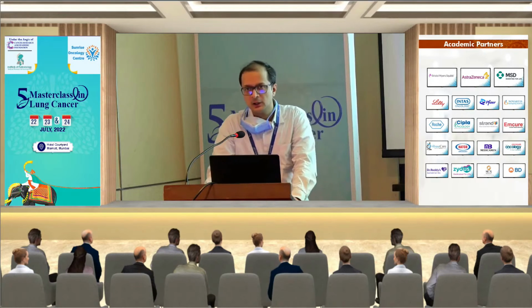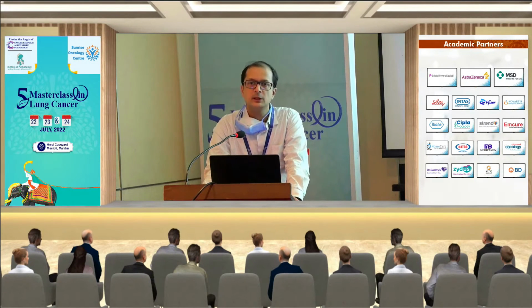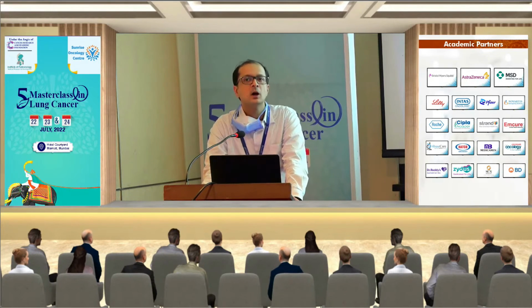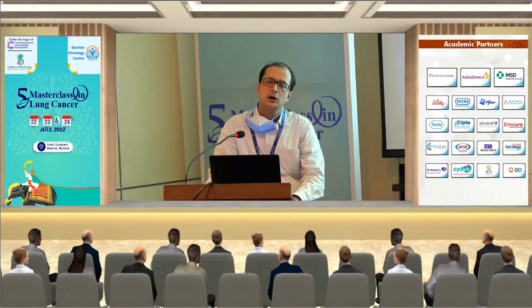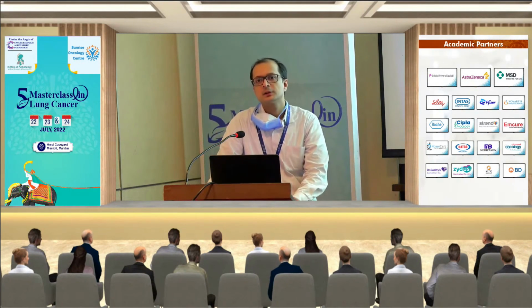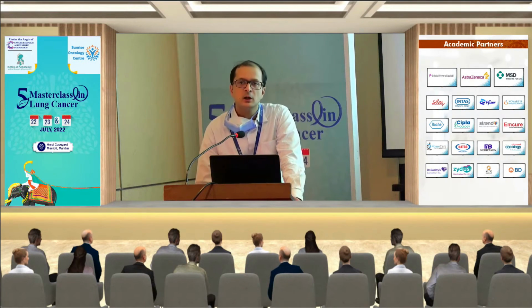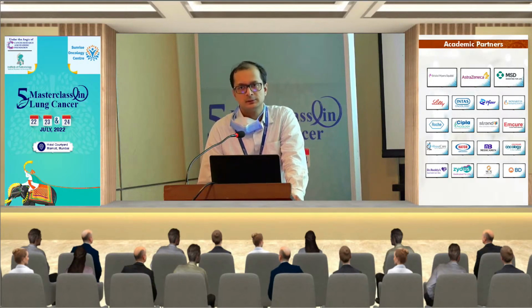In today's era, with the advent of more and more tissue being required for molecular analysis, percutaneous guided biopsy is much more preferable because you can get a greater amount of cores compared to an EBUS technique. With EBUS you get a small core, with a needle of less than 20 gauge. With percutaneous you can go up to an 18 or 16 gauge needle, and the quality of core is much better with the percutaneous procedure.